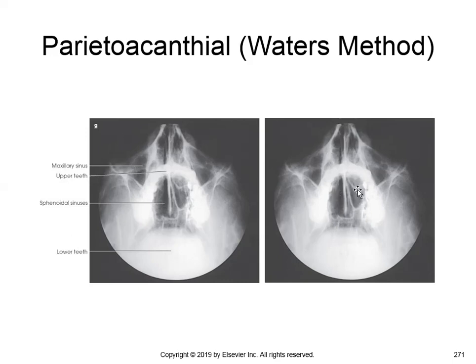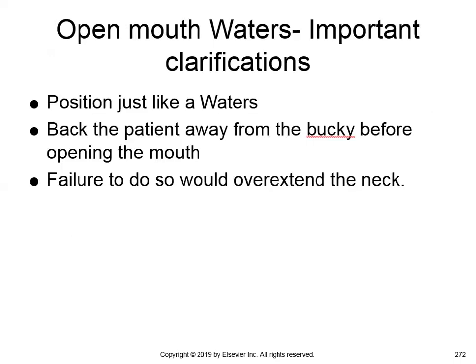So open the patient's mouth before you have the patient put their face up against the image receptor. But what we're trying to see is the sphenoid sinus through the open mouth, just like that.